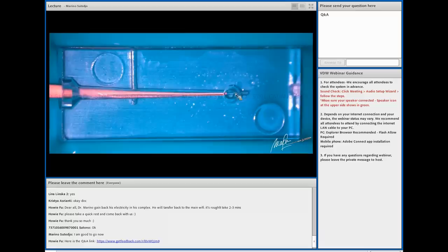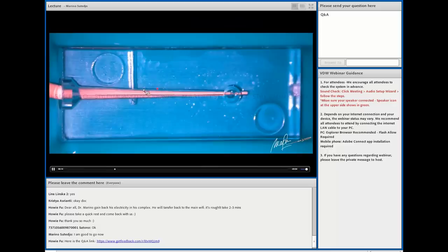So it means we also need to apply more activations to our irrigants. As you can see, if I put my gutta-percha, by doing it up and down, by activating our gutta-percha inside the root canal, you can have lateral pressure into the accessory canals. So these irrigants can clean all the systems by doing this. They will press inside all the anastomoses, all the isthmuses, all the accessories if they exist in our root canal systems. But if you just put your irrigants there and you don't do any activations, the irrigants will stay there. So we need something to activate, so that in a shorter time, we will have the same effect as if we put it in for a longer time. So manual dynamic activation is just a basic technique that we can apply.